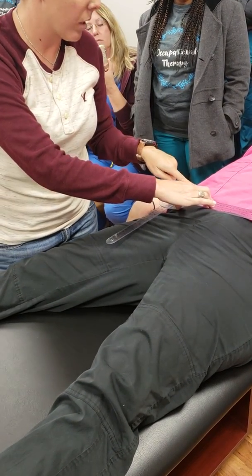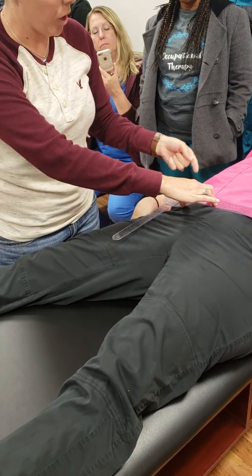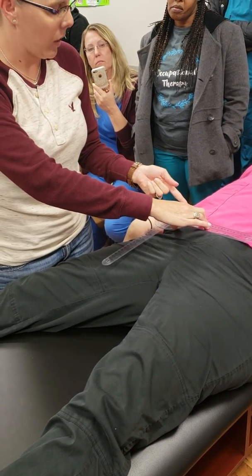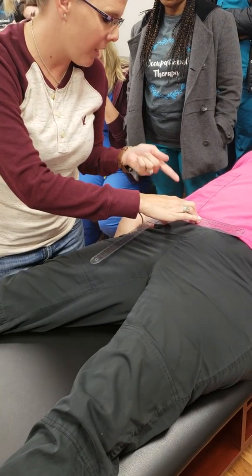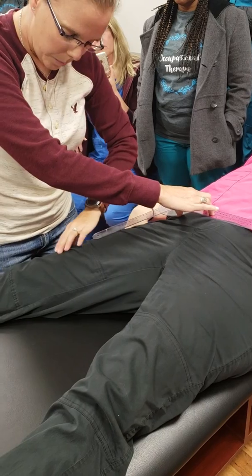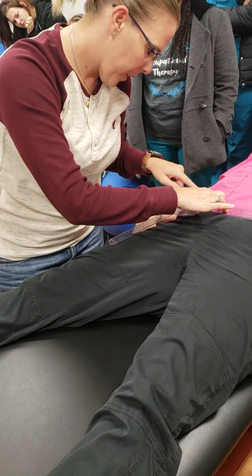There's red numbers on the goniometer as well that show 0, if you guys wanted to come look. Because it looks like I'm in 90 if I look at the black numbers, but if I look at the red numbers, it's 0. Then I go out, here's the midline of the femur, towards the patella, we went 20 degrees.